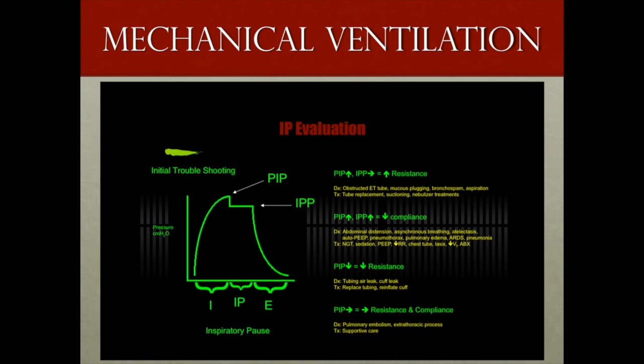Asynchronous breathing on the ventilator will lead to increased stiffness and decreased distensibility as well, affecting compliance, and this may be treated by changing the ventilator modes or increasing the sedation if need be. Atelectasis is very common and can be treated by re-recruitment with increasing PEEP. Auto-PEEP is a problem which we will talk about on the next slide. Its best treatment is to decrease respiratory rate.